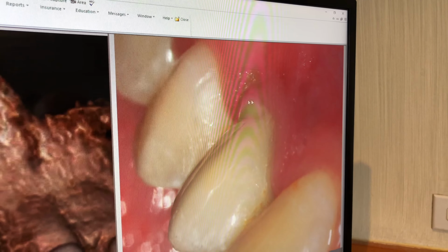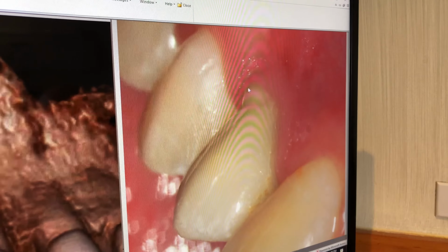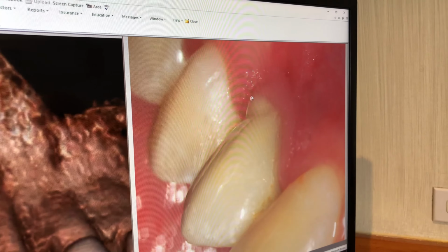When I pushed on the tissue, you can see this bolus of pus that we are extruding along the implant surface. And so there is infection that you cannot see. Now, when the patient smiles or is going about her daily business, she has no idea this is happening. Can you imagine? She's living with an infection in her jaw, a failing implant, and bacteria that can now seed from the jaw, from the tissue, the gum tissue, through the bloodstream into her body and can migrate to other systems inside her body. There's a lot of scientific literature that relates and speaks about this.